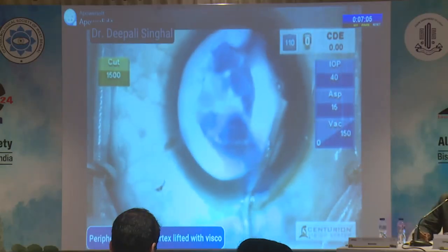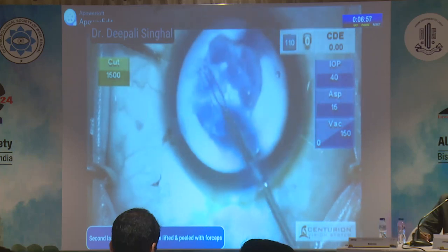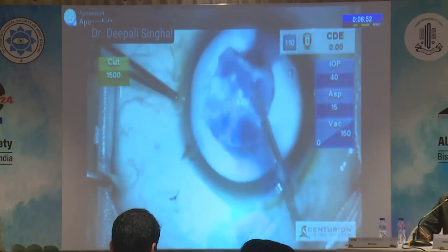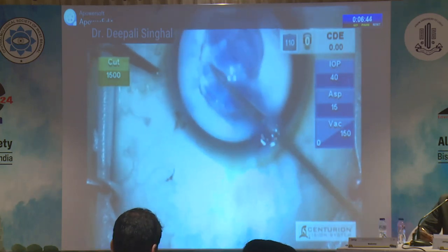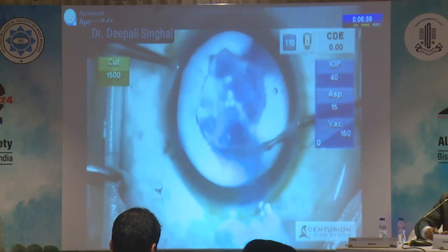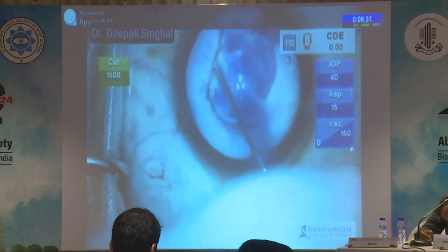Then gentle hydro and visco dissection done to separate and lift the peripheral hard cortex. Now a second layer of fibrosed capsule was noted and lifted with forceps and peeled. Then scissors was used to cut and separate the dense attachments of anterior capsule with the plaque and rhexis was completed. Visco is used to separate the plaque from the cortex.